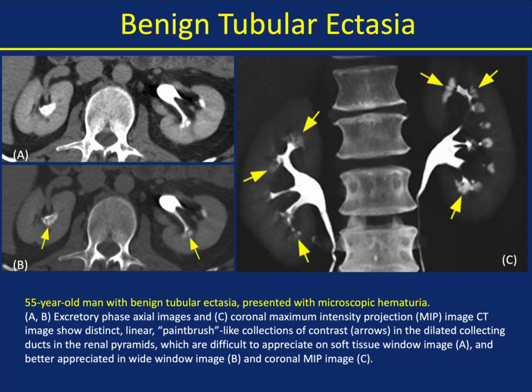Benign tubular ectasia in a patient with microscopic hematuria: the excretory phase images in axial and coronal and MIP images show distinct linear paintbrush-like collections of contrast in the dilated collecting ducts in the renal pyramids. These are difficult to appreciate on soft tissue window imaging but better appreciated on wide window imaging and on the MIP. Think about this benign tubular ectasia with that paintbrush appearance compared to the normal subtle blush.